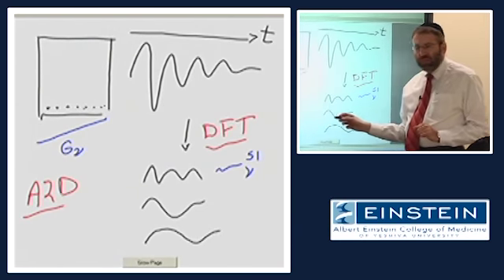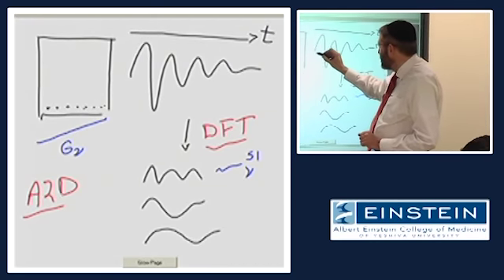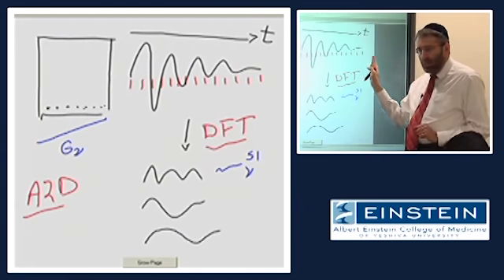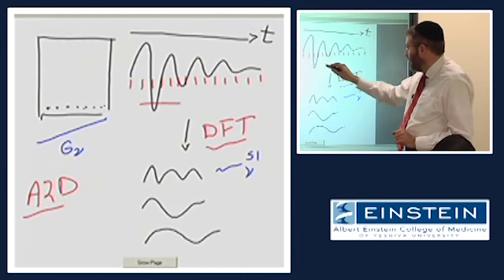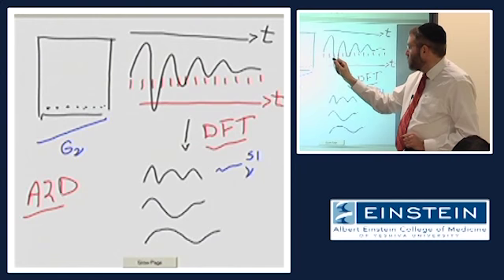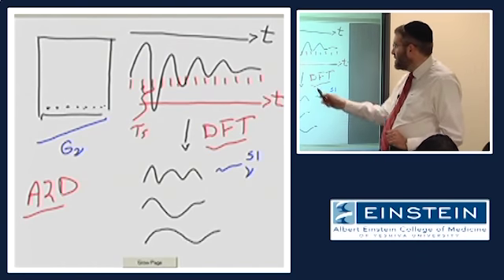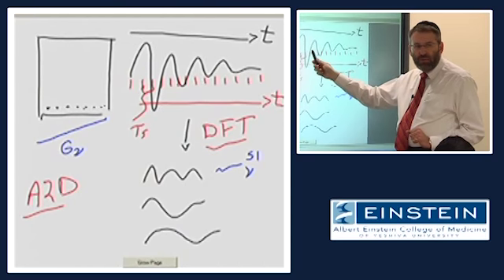To deal with this in our digital system, though, the analog to digital converter is going to essentially chop this signal up into a whole bunch of pieces of information that are collected over time. Right? So during each one of these periods of time, which we call the sampling time, or T sub s, the system records the total signal amplitude that occurred during that period of time.